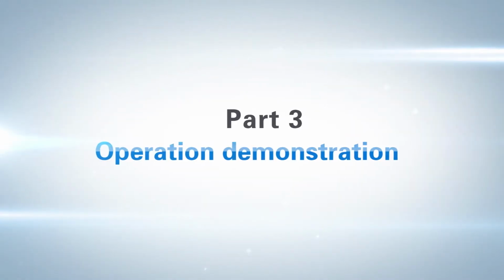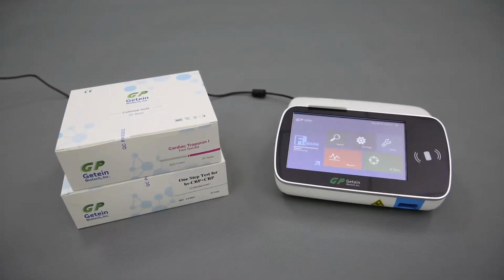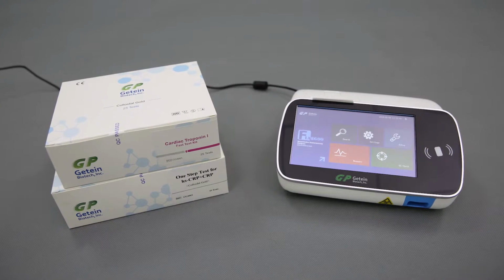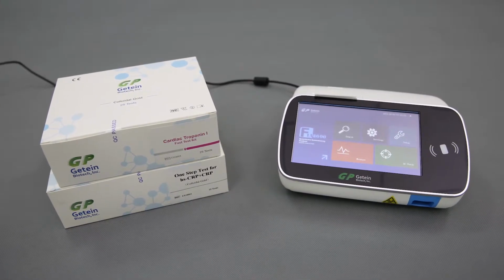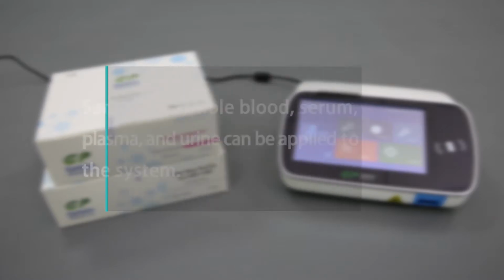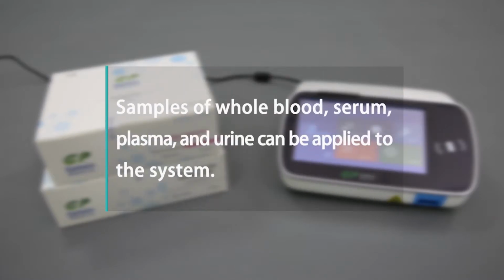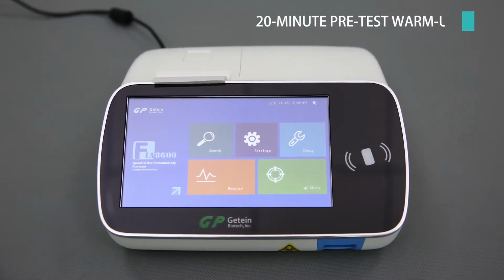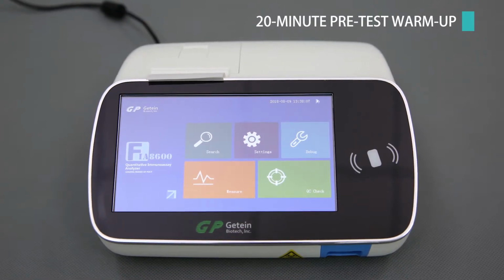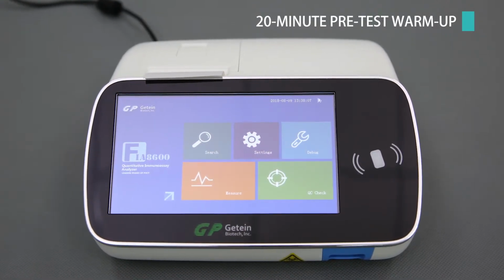Part 3. Operation Demonstration. FIA8600 Quantitative Immunoassay Analyzer shall be used with matched reagent kits as listed in the table below. Samples of whole blood, serum, plasma, and urine can be applied to the system. To ensure the accuracy of measurements, please allow 20 minutes of warm-up time for the instrument before testing.